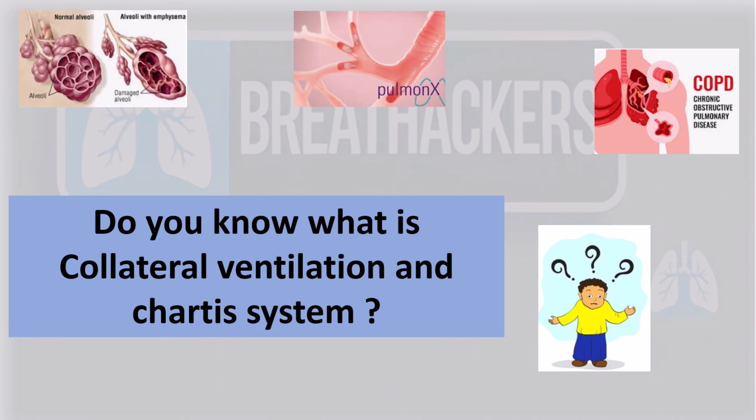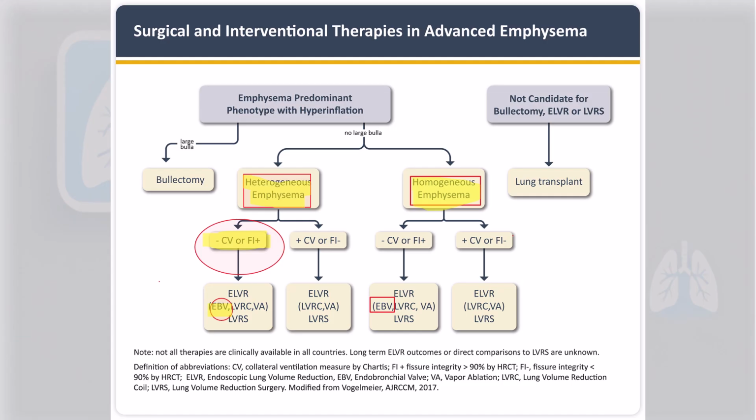Hello everyone. So today we'll be discussing collateral ventilation in the Chartis system. This is one of the tables from the GOLD Guidelines, which talks about surgical and interventional therapies in advanced emphysema.